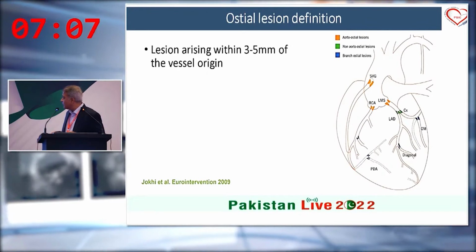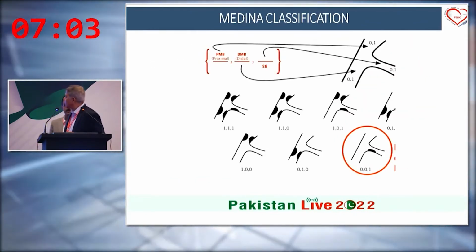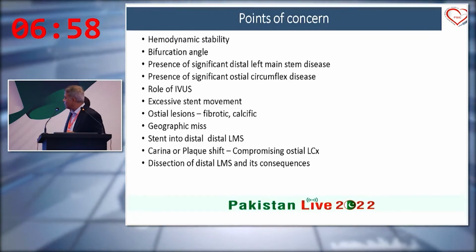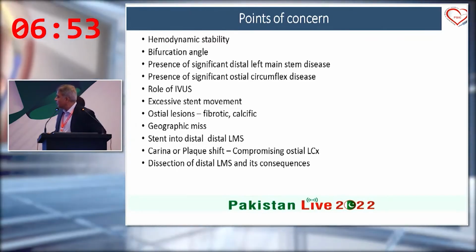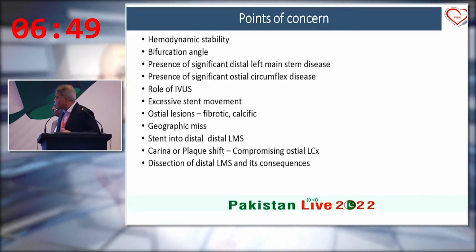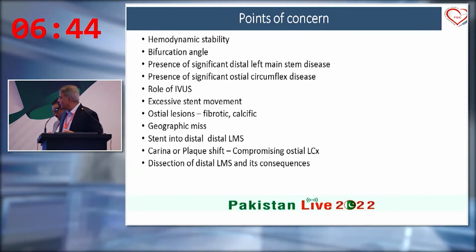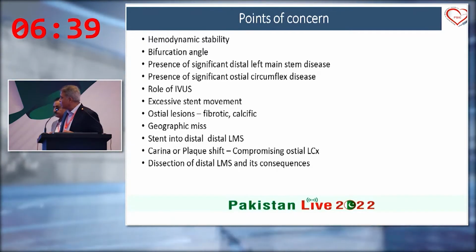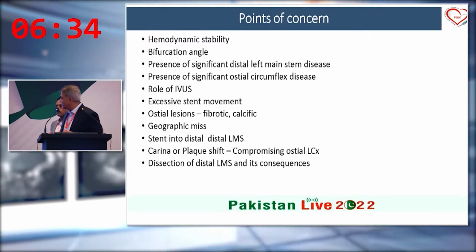Basically, this is all theoretical discussion. Ostial LAD. Okay, this is the Medina classification. Points of concern, if you allow me just 2 slides, I would like to discuss with the other operators. We should concentrate on hemodynamic stability, the bifurcation angle, which has already been discussed with the prior operators who delivered lectures, the presence of significant distal left main disease, and the presence of significant ostial circumflex disease.